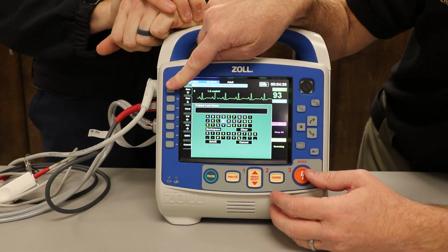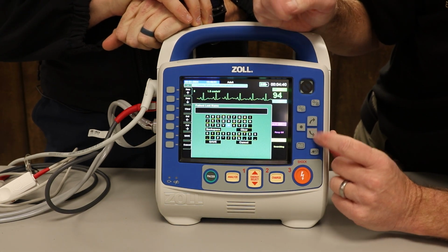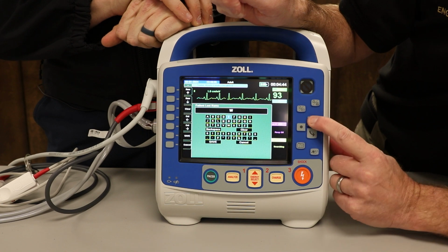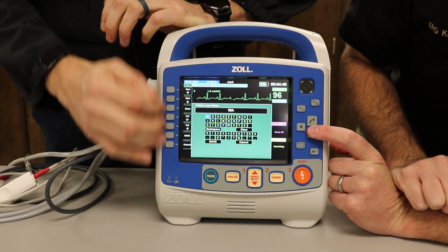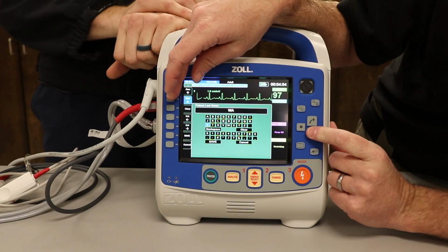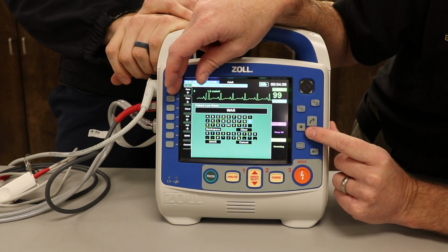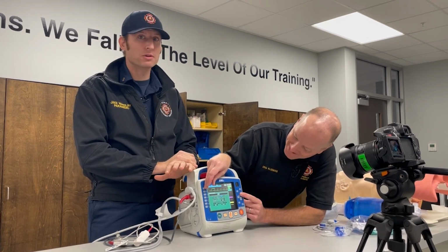But look at these side buttons. I can actually go down one row, over one, click a button, go back up, then go over. People tend to forget you have an option to manipulate on this side. It's so easy when you manipulate it that way to actually spell your name faster. Even then, you still have to practice. I don't know how many Wardlaws are on Station 12's monitor, but there's a bunch. You're going to have to practice this to be efficient with it. There's just no way around it.